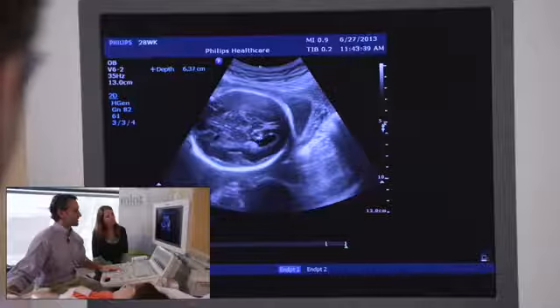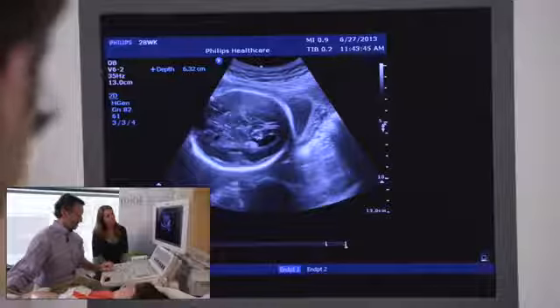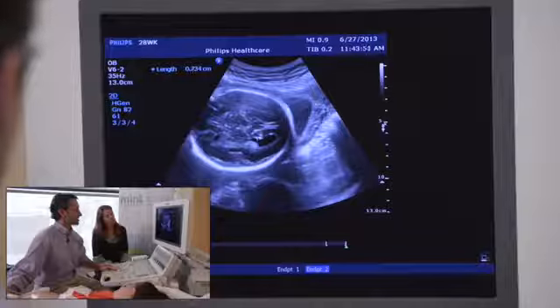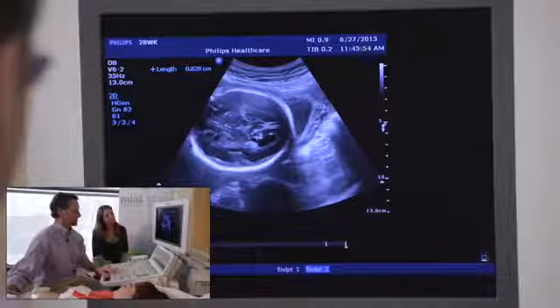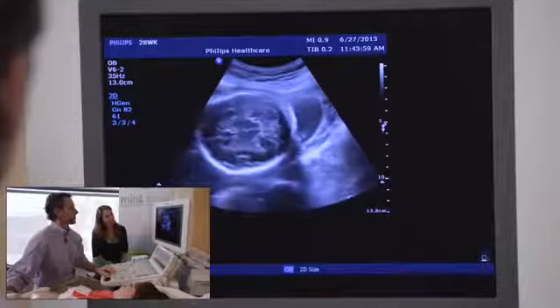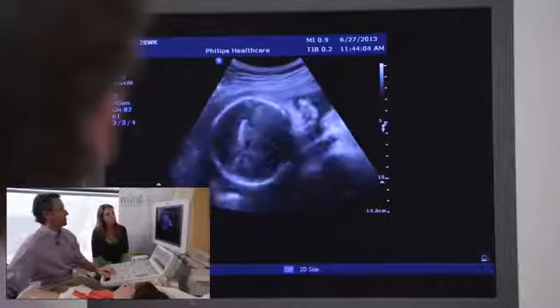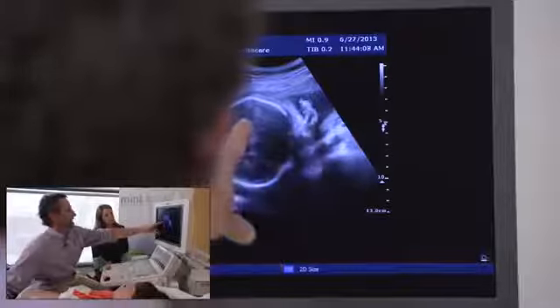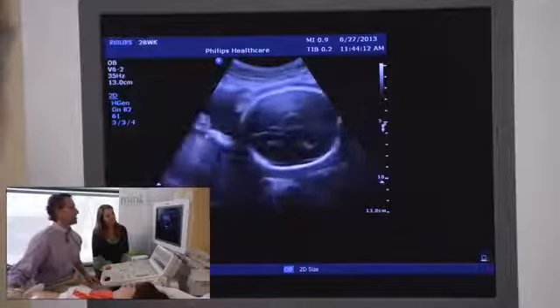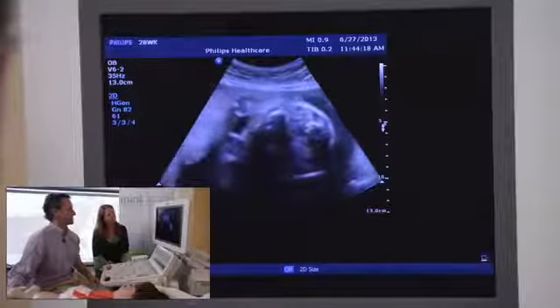I'm not going to do a lot of measuring right now, but I'm just going to show you to measure the lateral ventricle. We want to measure right across this area, which is called the atrium of the lateral ventricle. It's right across where the choroid starts to curve in here. I apologize, this isn't the most perfect picture of a ventricle, but that's basically how you want to measure it. If you do need to look at the upside ventricle, you can swing around and use some tricks and come in from the back, and then you can see that there is in fact a ventricle up there, but it's not necessary to do that in every case. We assume symmetry unless there's a reason to assume otherwise.